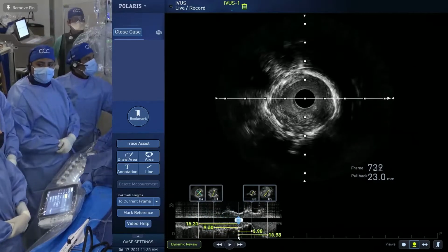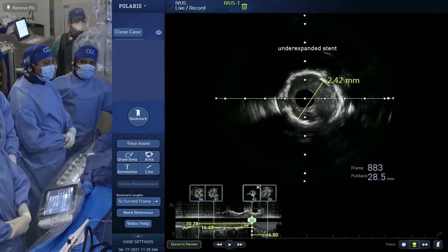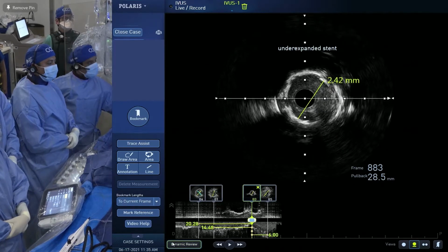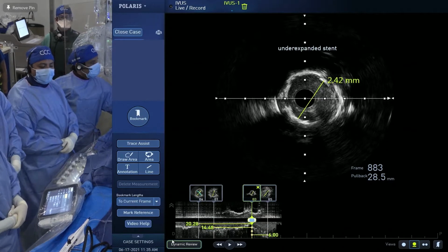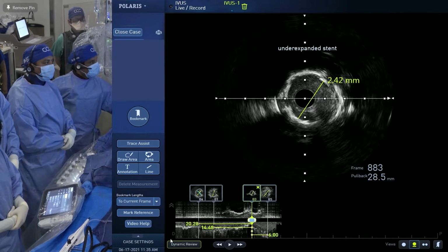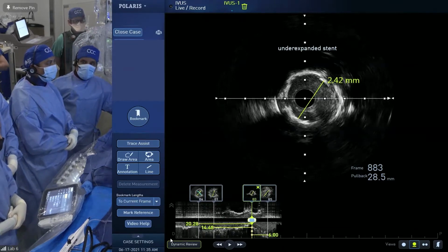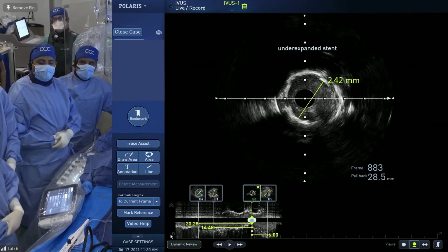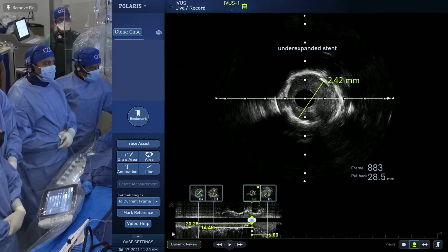What's your approach? The vessel lumen itself is actually relatively large. For vessels that are less than 2 millimeters, we try to actually burr out using rotational atherectomy to really remove them. I think it causes microfracture, so that allows expansion. I would be really curious in this setting whether or not a Shockwave would actually work. It looks like it's something they did after they stented when they recognized that this was an issue, and it looks like they didn't get anywhere.